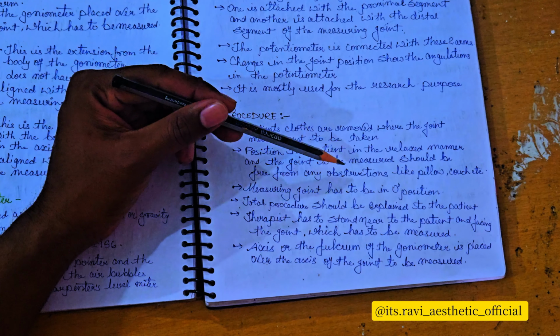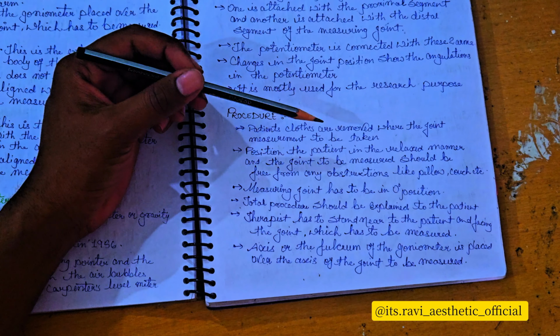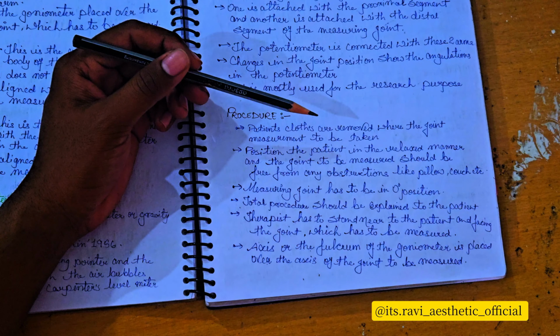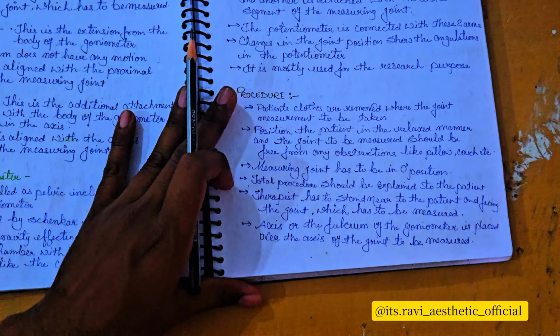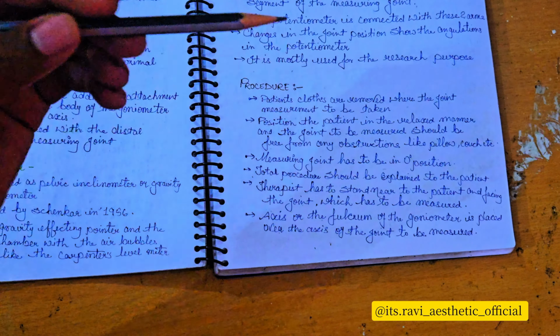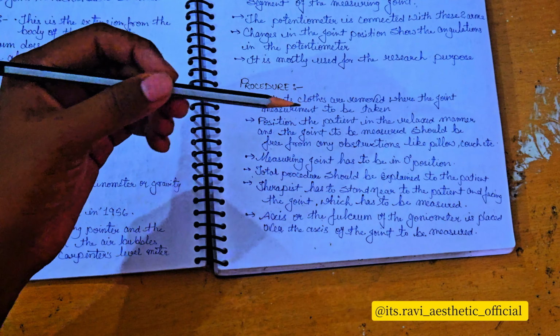The measuring joint has to be in the 0-degree position. Before starting the measuring of range of motion, first we take the 0-degree as the starting position. The total procedure should be explained to the patient before doing any range of motion activity. Explain each and everything to the patient.